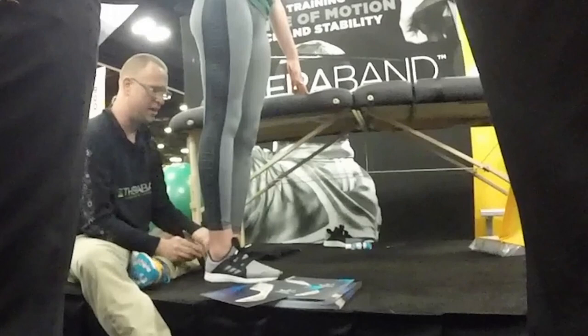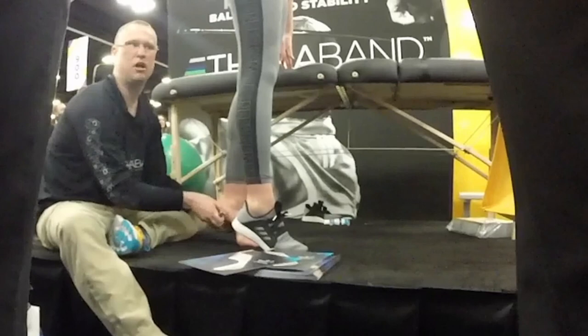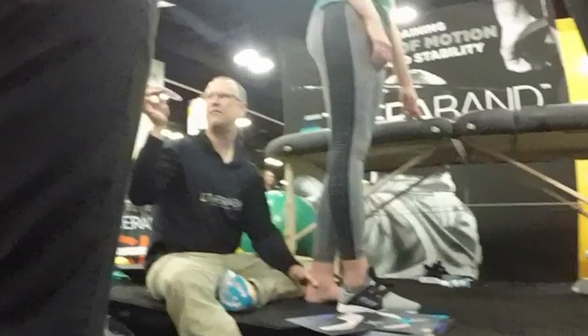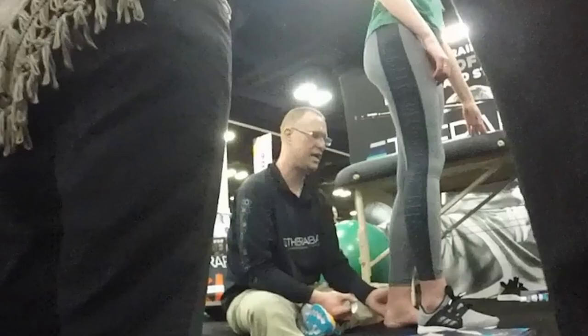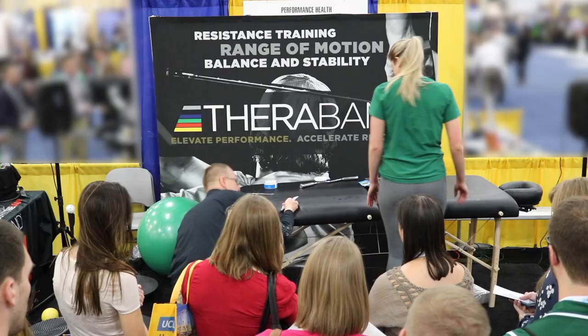As they do the heel raise, I take the instrumentation very lightly and work into that plantar fascia in the loaded position — because loaded is where they hurt. They don't hurt passively. I don't do this on visit one — it's a little aggressive — but my goal is to get them there. The value to the patient is that this is much more engaging than, say, having a tech apply ultrasound for eight minutes that they can't feel.